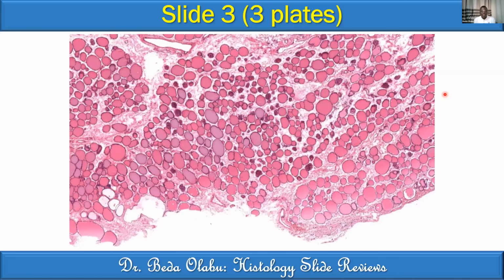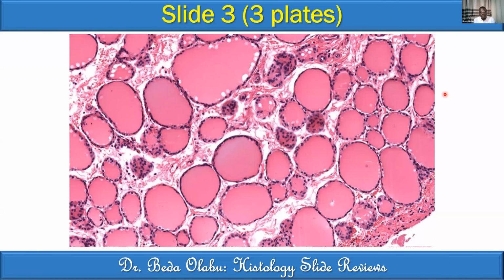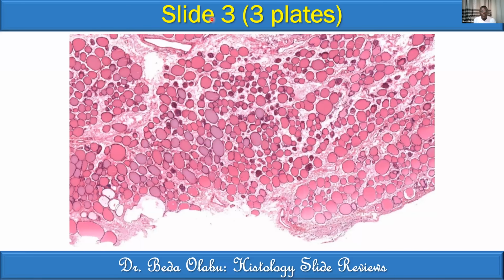Right, second level magnification. Just put down what is new. Third level magnification. You can capture what's new. Right, I believe you're good now. So I'll take it to the lower magnification again and give you opportunity to describe.